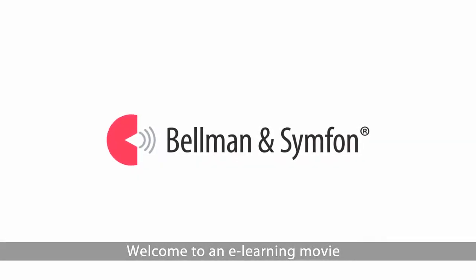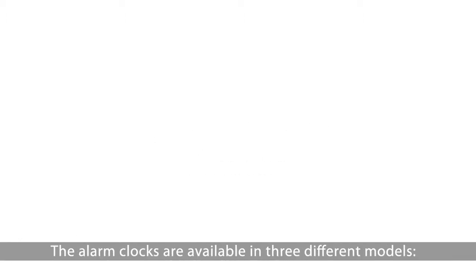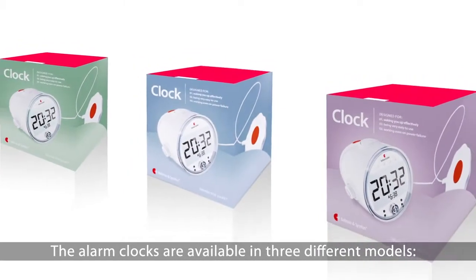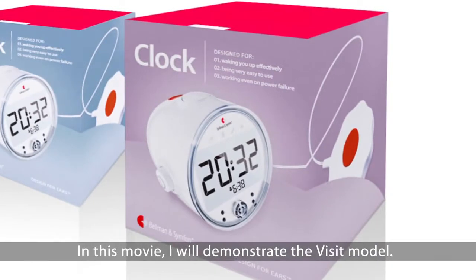Welcome to an e-learning movie where we'll be looking at the new range of alarm clocks from Bellman and Symforn. The alarm clocks are available in three different models: Classic, Pro, and Visit. In this movie I will demonstrate the Visit model.